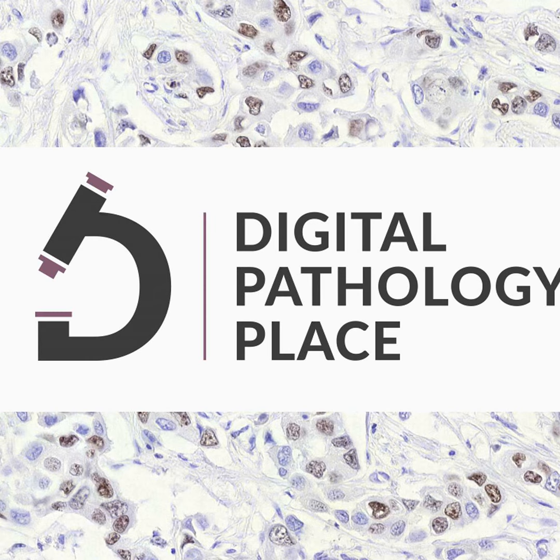And before we dive into what swarm exactly means, can you tell me about the concept of decentralized AI and why it matters? Yes, definitely. I would like to give a small introduction on decentralized learning. So before we go into decentralized learning, it is important to know what is local learning or centralized learning, right? Because then I can give a better, exactly, all the different concepts that we need to know before we can appreciate how novel your work is actually in the histopathology space. Yes. So as I already told, local learning is something where you have one center with maybe 100 patients. So they want to train a model locally. So they have a physical system in which they put all the data and then they train a model. So this is called local training, or somehow a training in a specific center.